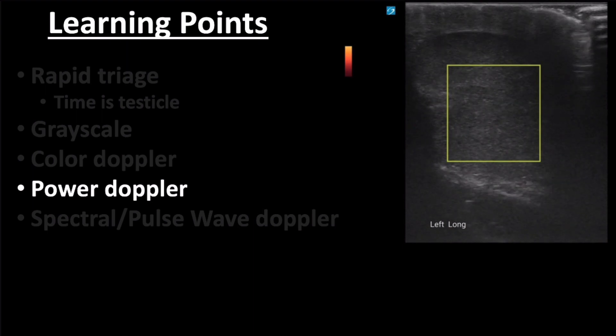One of the negatives of utilizing color Doppler is a limitation in low flow states, like in prepubertal patients with low testicular volumes.